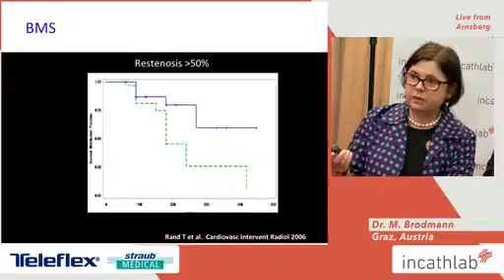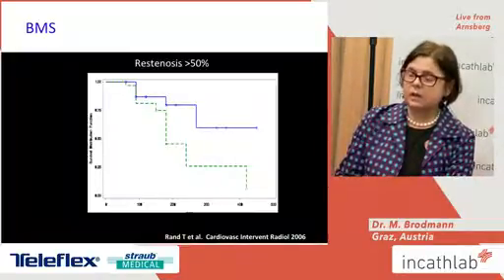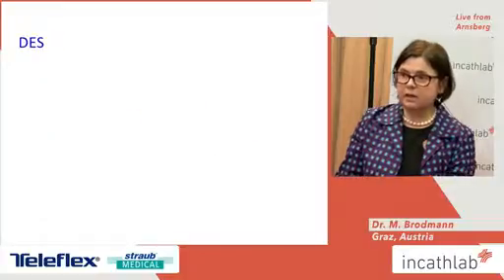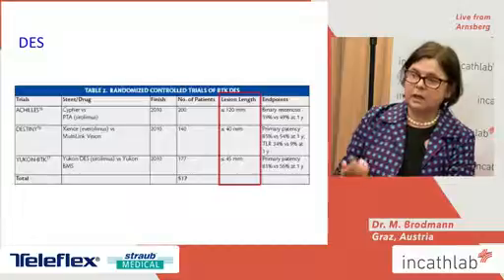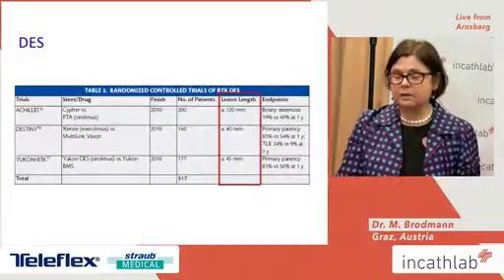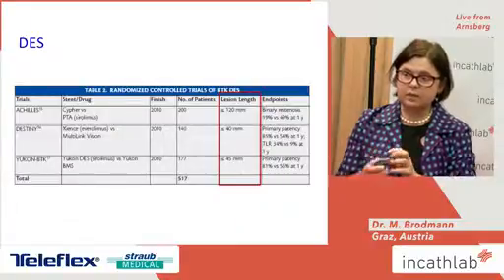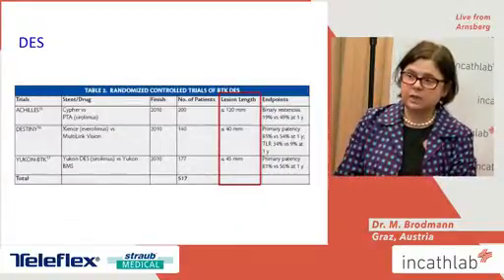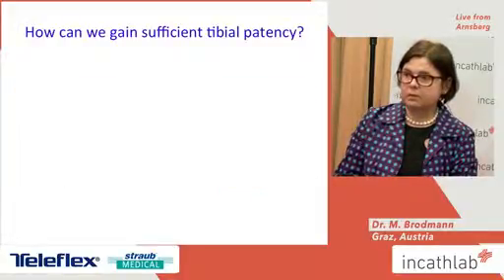We also have the data from RAND that this is not the ideal treatment at the end of the day. We have discussed drug-eluting stents already. I think this is a good option, but as we already mentioned, it's usually only for spot stenting, so we cannot cover the whole length of the lesions we need to treat, and this is a problem too.